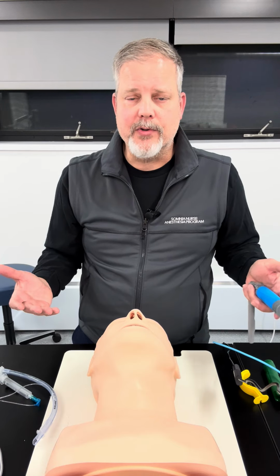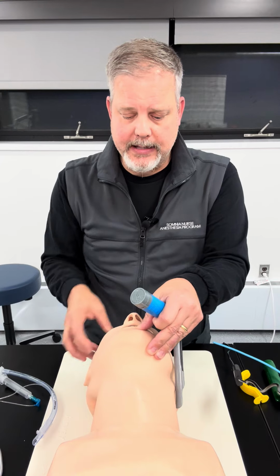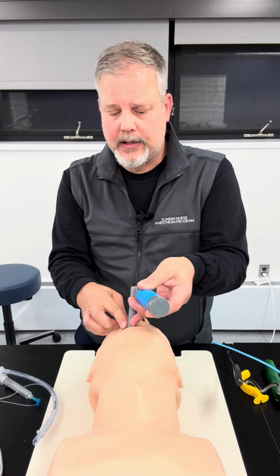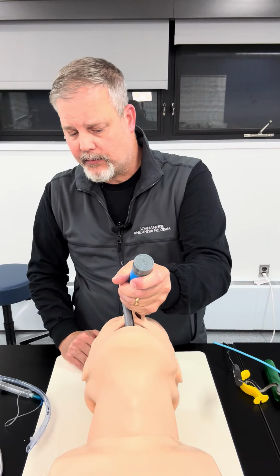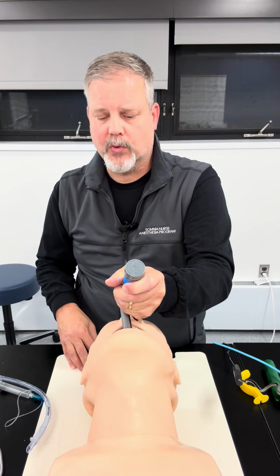So the patient's been put to sleep. We're ready to now do our direct laryngoscopy to intubate our patient. So we get them in a sniffing position. We scissor the mouth open. We then place the blade in there on the right side, sweep up and out to see if we see the vocal cords. And right now I've got a very poor view of the vocal cords.